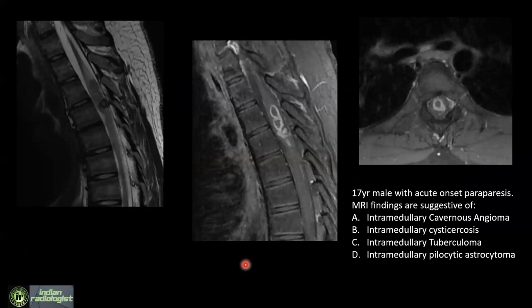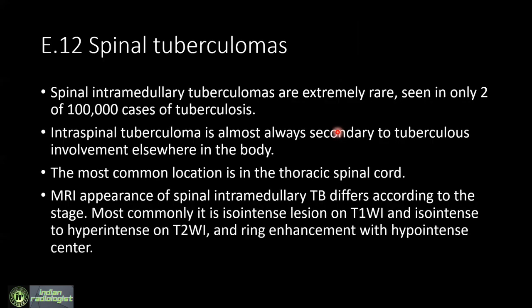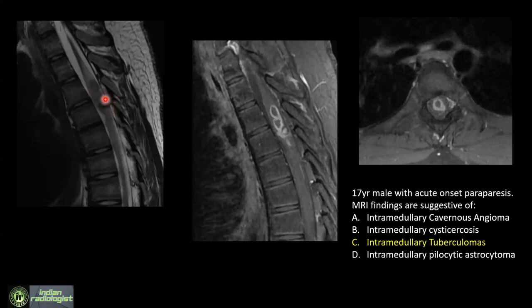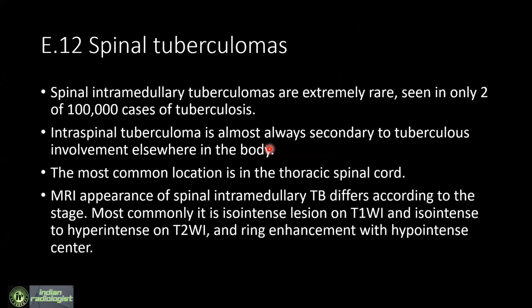The next question shows sagittal T2, sagittal T1 post-contrast, and axial post-contrast images. These findings are commonly seen in the brain but rare in the cord. 50% identified them correctly as intramedullary tuberculomas. These are typical T2 hypointense lesions which are peripherally enhancing with perilesional edema and conglomerate appearance. Spinal intramedullary tuberculomas are rare and usually secondary to tubercular involvement elsewhere; this patient also had multiple tuberculomas in the brain and pulmonary involvement.